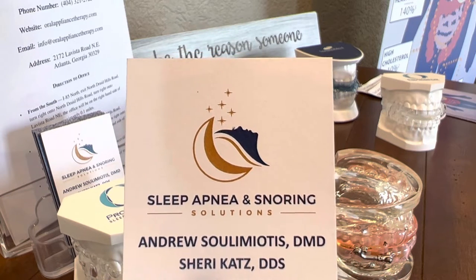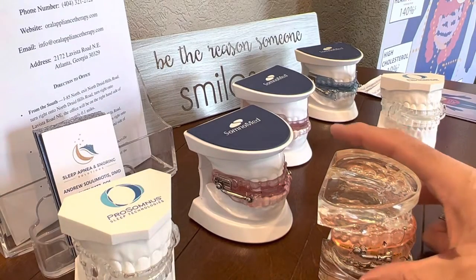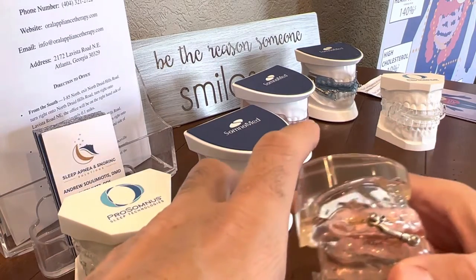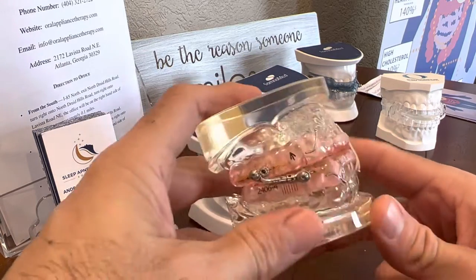Hi, this is Dr. Andrew Sulamiotis at Sleep Apnea and Snoring Solutions. I'm going to show you how we titrate one of our devices, that is adjusting it or bringing the bottom part forward. This one is the WholeYou Herbst.